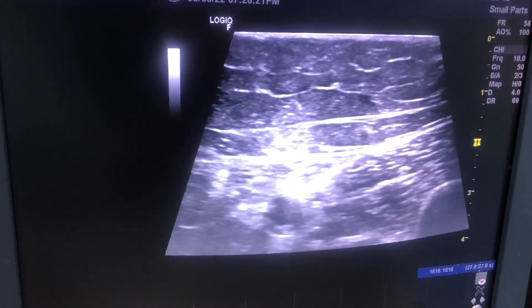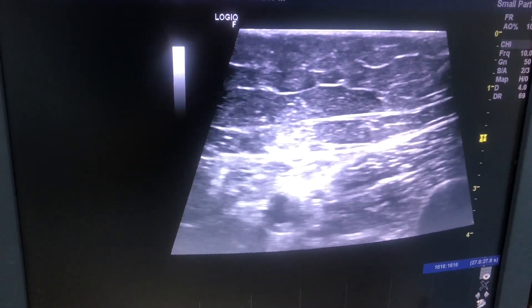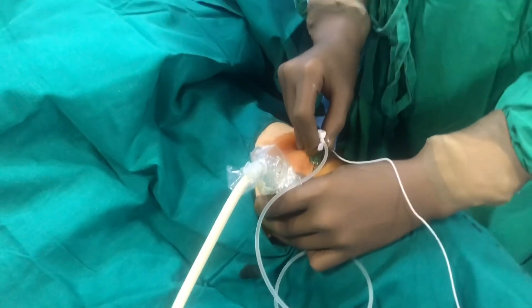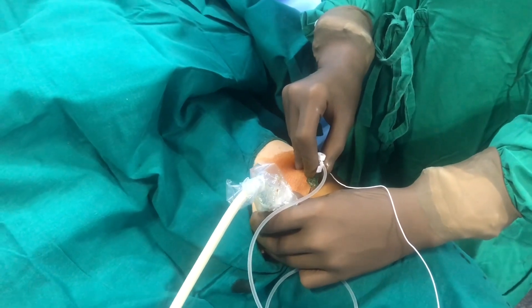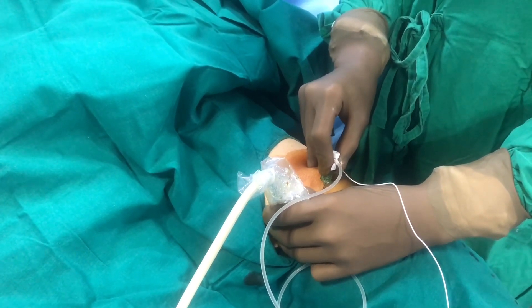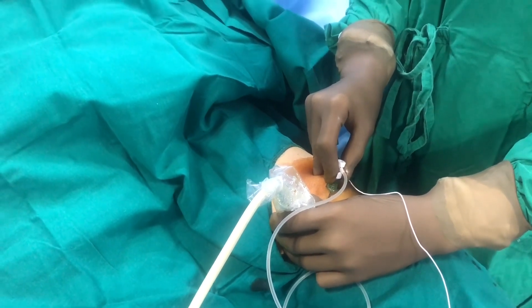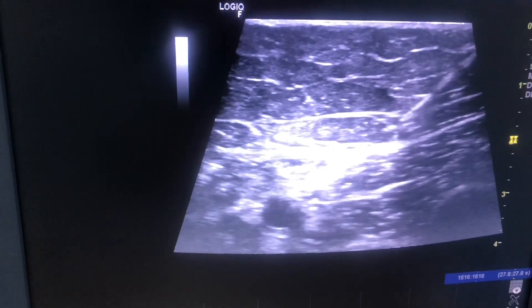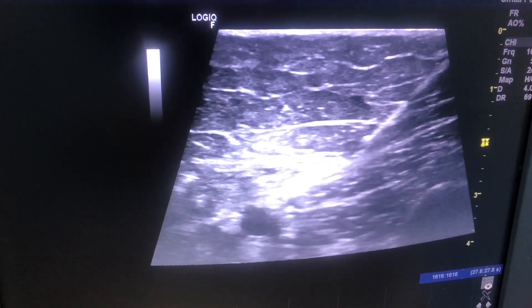Can you show here please? Initially I could not see the needle. The only thing I did was angle my probe a little bit until I saw the needle well, and then I keep it in this fixed position. Can you show on the screen now? See — the needle is now beautifully visualized.